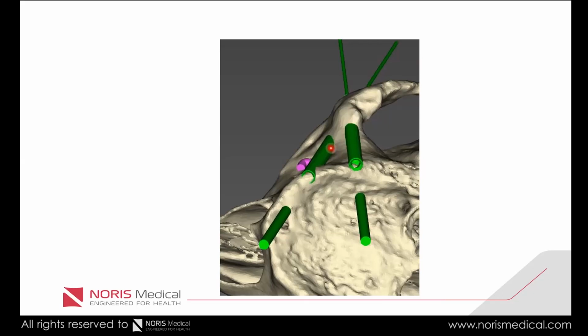This is also a question where we have two views about it. What should be done first, the anterior implant or the posterior implant? Some would say the anterior, and some would say the posterior. I've heard some explanation why to do the posterior first, because sometimes it is important to be able to put it as distal as possible. That's why I'm putting it first.